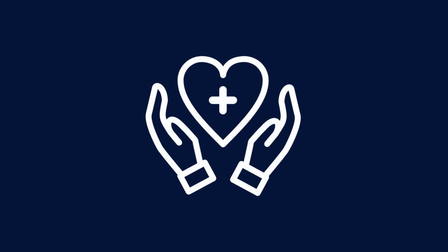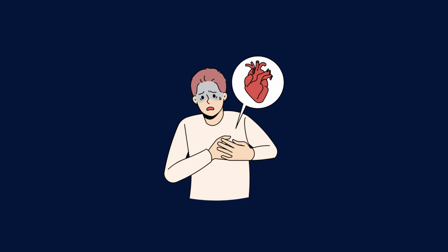An ECG can provide valuable information about a patient's overall cardiovascular health and is often used to monitor patients with existing cardiovascular conditions. It can also indicate if a person has experienced recent events such as a heart attack.